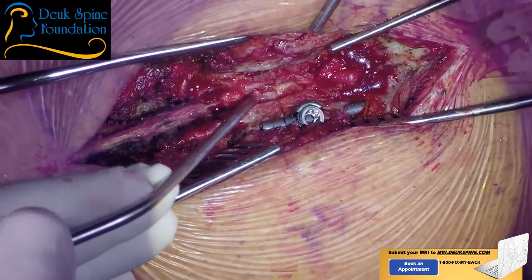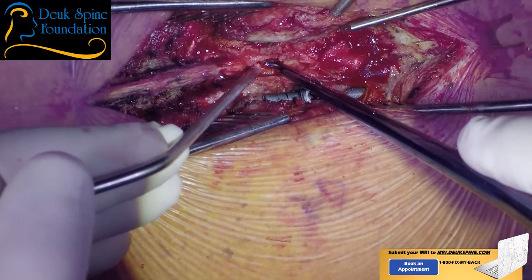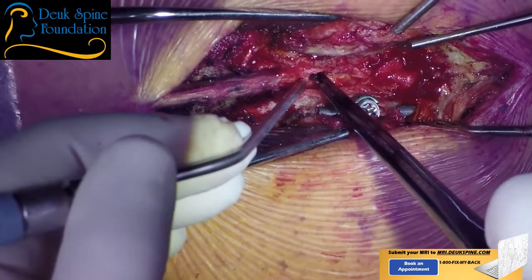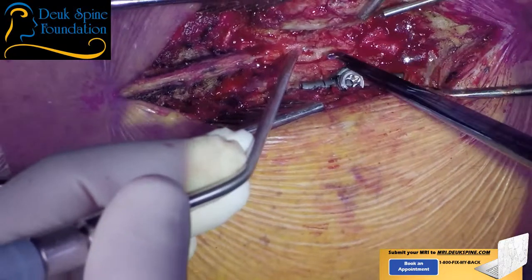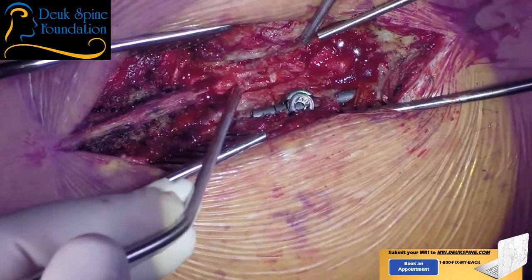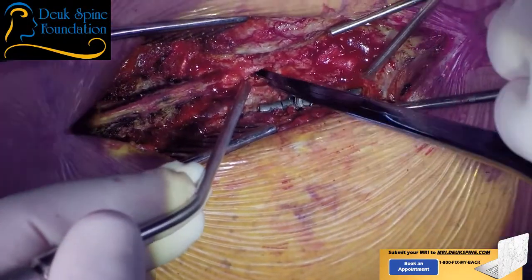Once again, this is called a laminectomy. There's a spinal cord. I'm trying to just keep staying just above the spinal cord. It's kind of scarred on the surface. It doesn't have its characteristic beautiful white appearance because it's scarred up a bit from prior surgery.